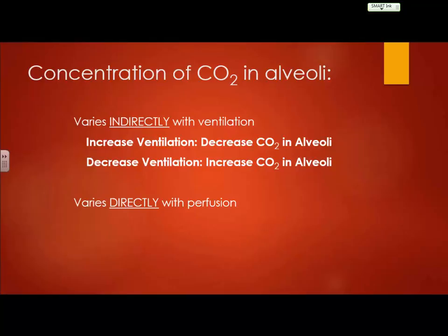All right, decreased ventilation would create an increase of CO2 in the alveoli. Think hypoventilation, right? What's happening? You're not breathing out quick enough to get it all out, and what's happening to CO2? It's just kind of hanging out, right?